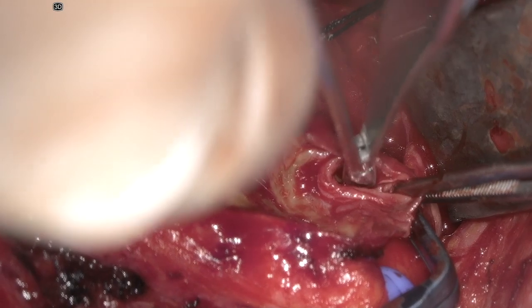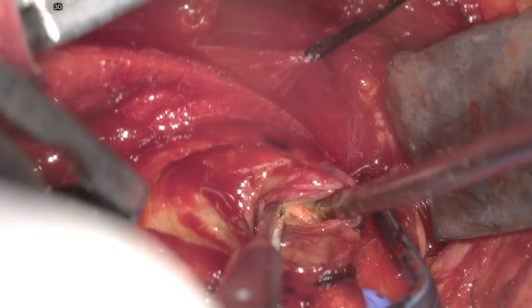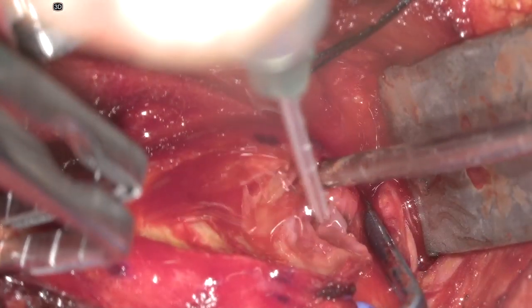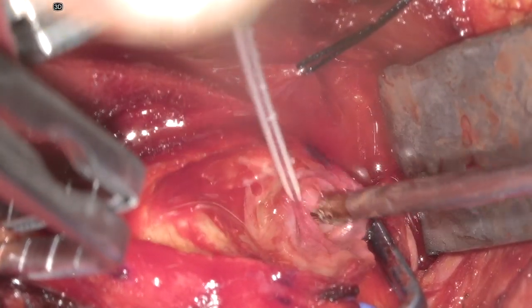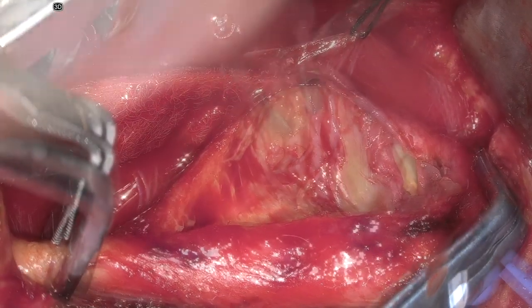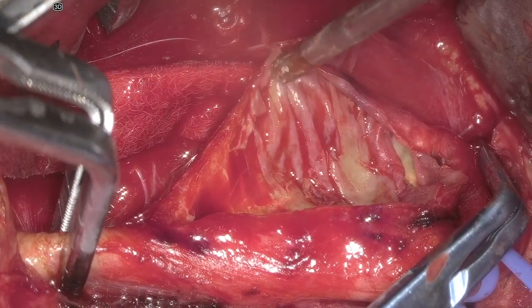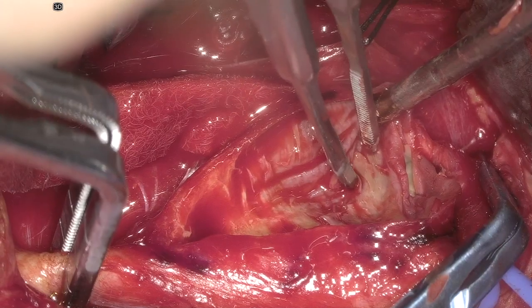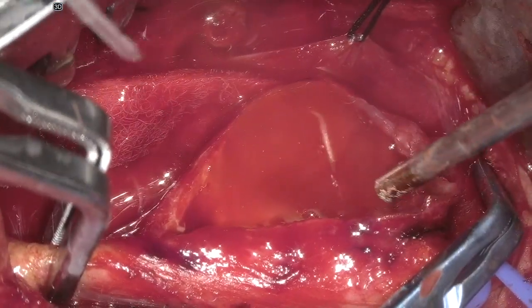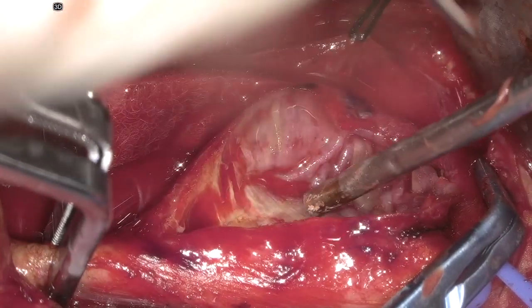At the end, this laid against the artery without elevation and looked quite good. We stripped the last little pieces of intima away from the vessel wall to ensure nothing was loose, then irrigated with heparinized saline to check for loose fragments. The last small bit was elevated off perpendicular to the arteriotomy.